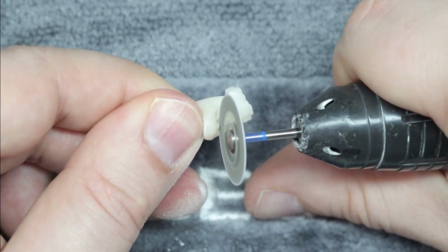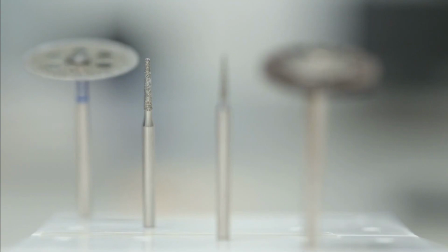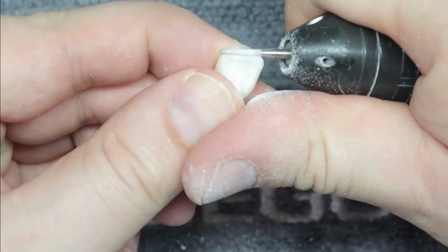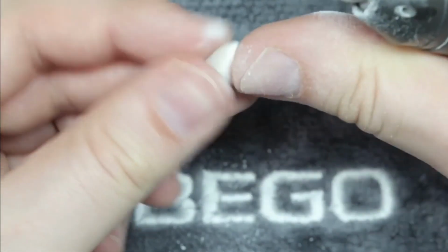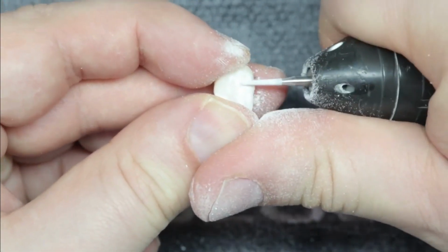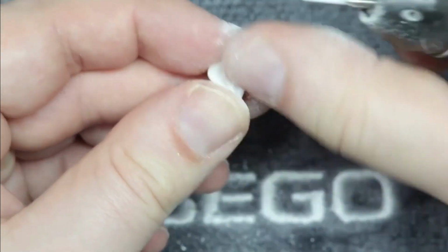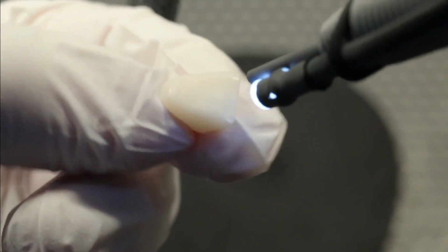You'll remove the supports before sandblasting. That allows you to reach all the areas very easily. So you can cut the supports with the diamond disc and then finish them with diamond burrs or carbides, fine or superfine. Here you can also carve anatomy in if you would so choose. It is easier in the green state.